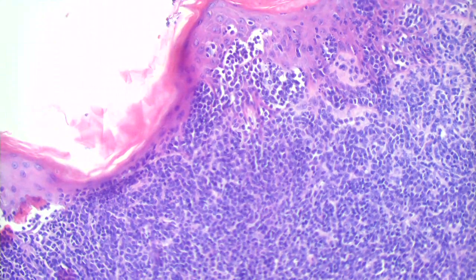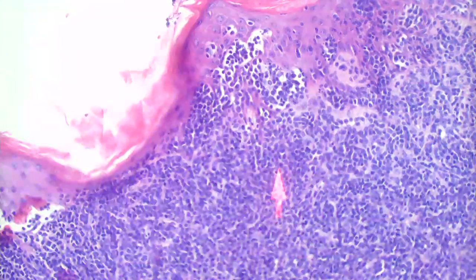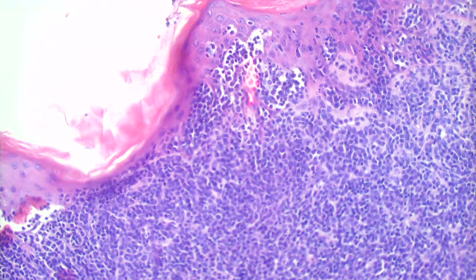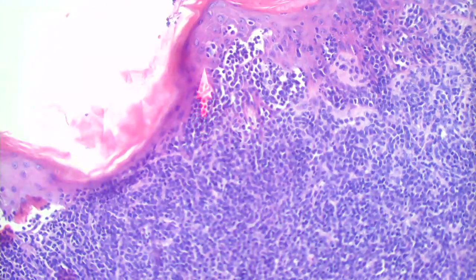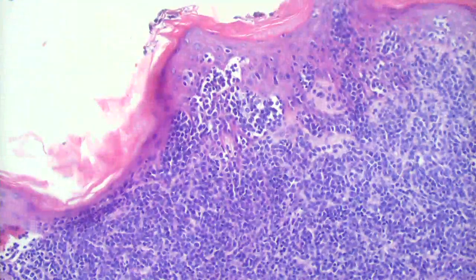Well, there's two main reasons. One is the cell morphology, so when the cells look cerebriform and convoluted. And then there's also epidermal involvement. Yeah. So what's the diagnosis here? Sort of T cell lymphoma. Yeah, any specific one that you'd like to throw the name out on? Yeah, this is mycosis fungoides, tumor stage.